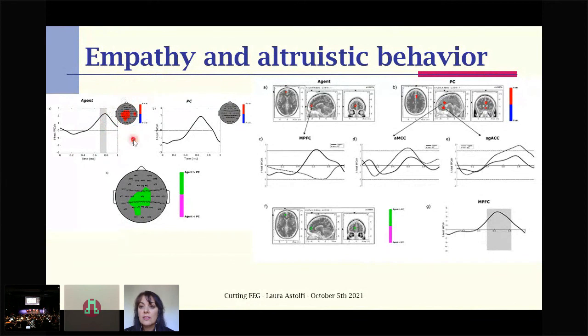Of course, there's a lot of statistics behind it to get rid of any spurious correlation. What we get is some kind of specific synchronization in time and located somewhere on the scalp. But if we move to the source domain, it's much more interesting what we can see, because here we can see the involvement of specific regions, both cortical and subcortical.